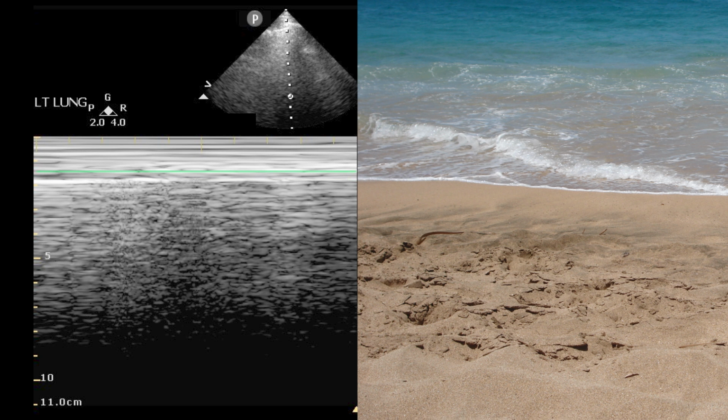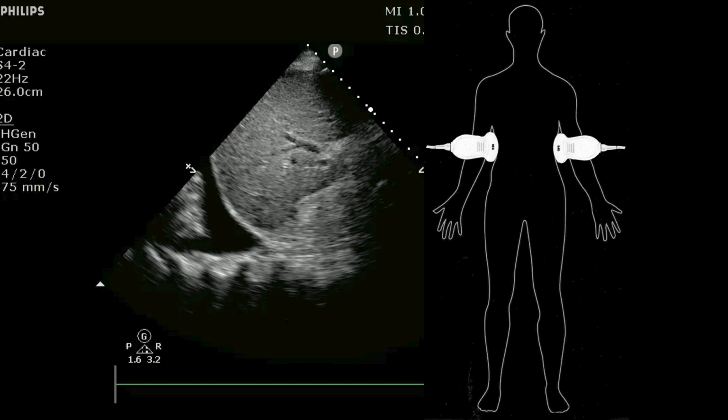Now, that's great if you have it. What does it look like if you have a pneumothorax where you have no lung sliding, right? And we call that the barcode sign, right? And so you can see if there's no movement above or below or at the pleural line, everything is going to have that striated appearance, right? It's going to just be streaky all the way across the screen. And this is what we call the barcode sign. Some people call it the stratosphere sign, but the barcode sign is traditionally what I've referred to it as.